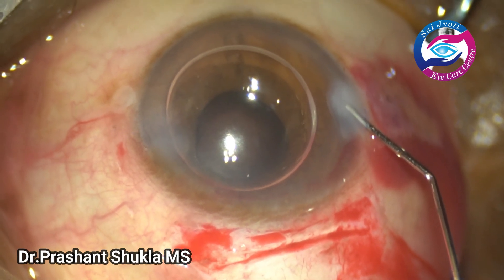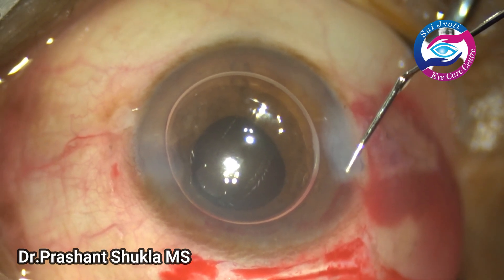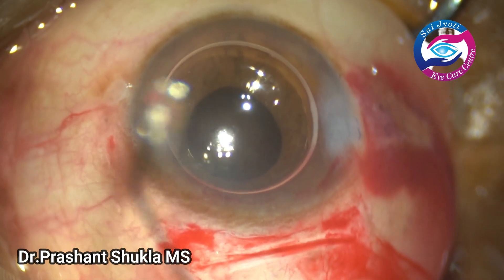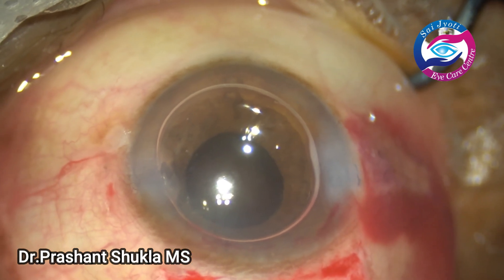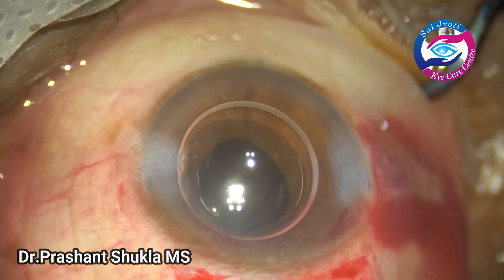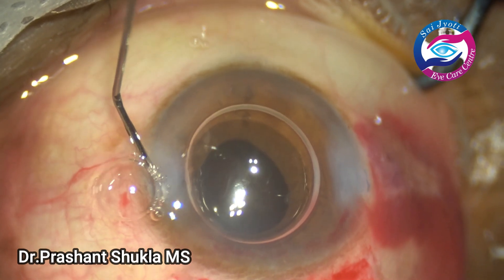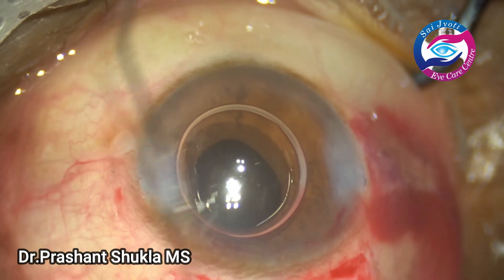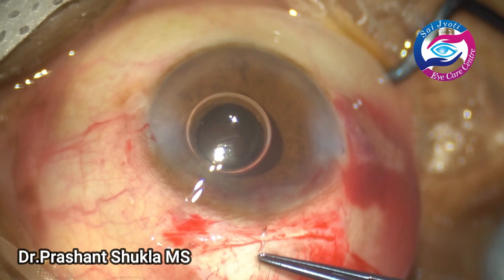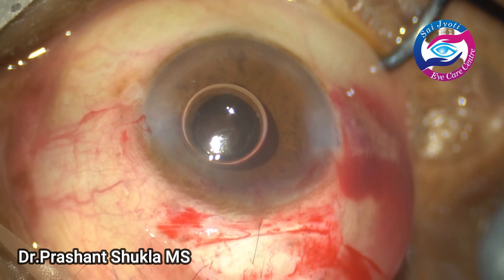Now is the time to close — I am hydrating the side ports. The chamber is nicely formed after hydration of both side ports. I have put one 10-0 nylon suture in the centre of the wound just to counteract the against-the-rule astigmatism which would have been created by this large incision.